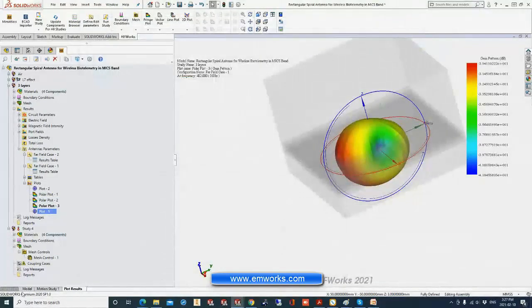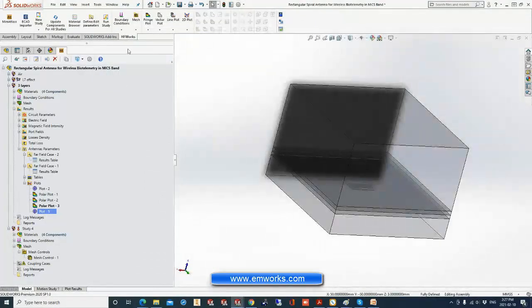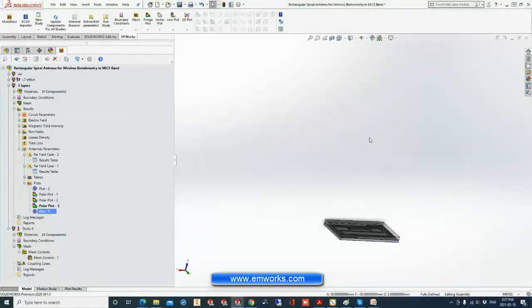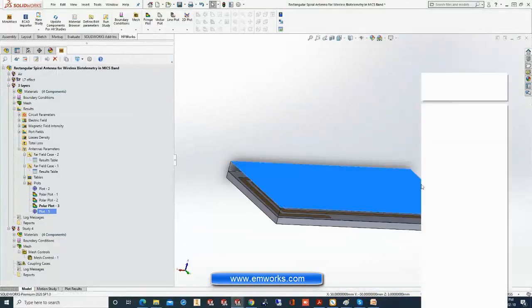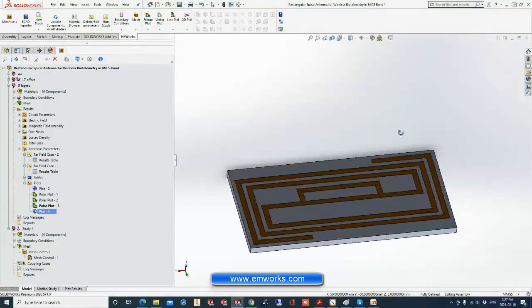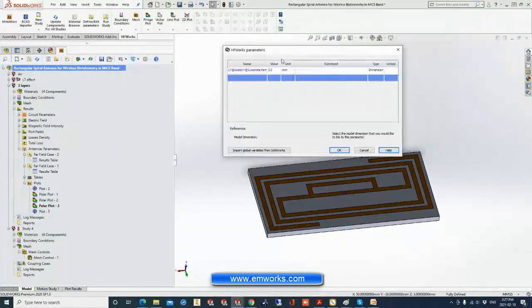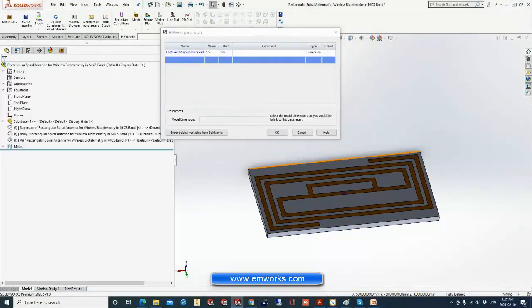Another advantage of having the solver inside SOLIDWORKS is the parametric study. By using the parametric study, you can change anything in the geometry. For example, let me hide the layers to have access to the substrate. Here we can define a parameter. I already selected the parameter, which is the length of the spiral antenna.